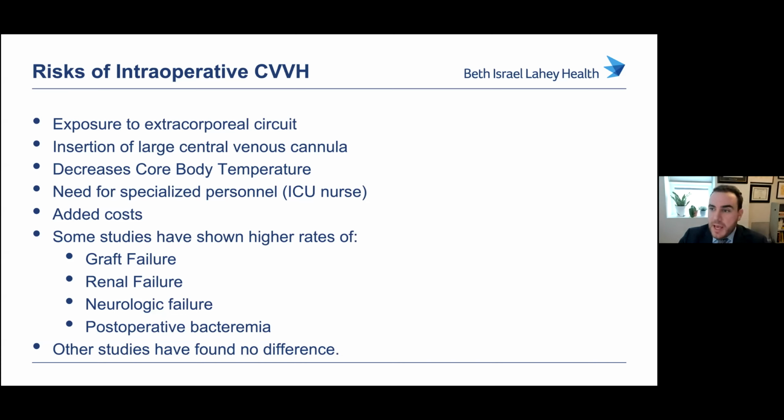Renal replacement therapy has come a long way since its inception. There's 3 types of ways that you can prevent filters from clotting using anticoagulation. The first is that you can give heparin through the CVVH before the filter. And then after the filter, you can infuse protamine to prevent that heparin that flowed through the filter through the blood from going systemic. The next is that you can use citrate.